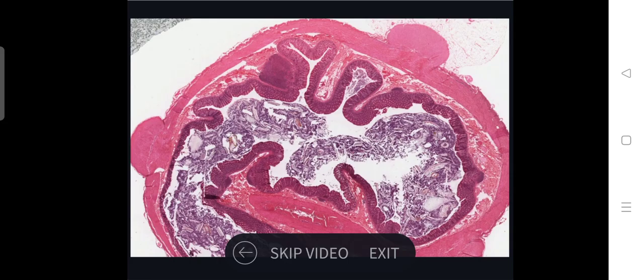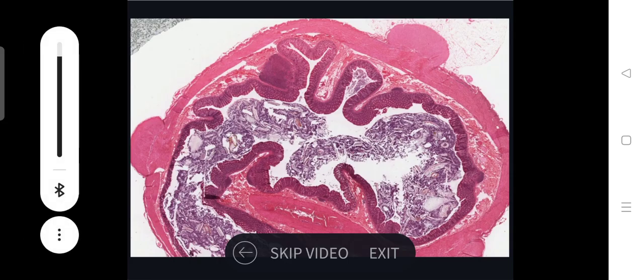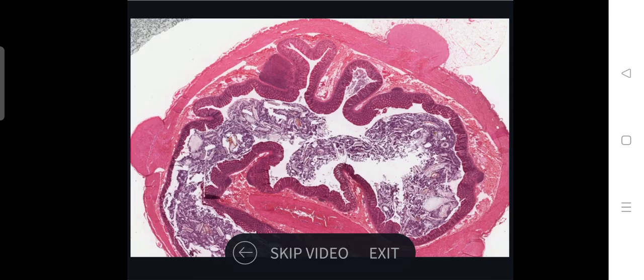The large intestine, or the colon, conforms to the essential features of the gastrointestinal tract. Here's the lumen. So we've got the mucosa, including the muscularis mucosa, the submucosa, muscularis externa, and then the serosa. A principal specialisation of the colon relates to its external longitudinal smooth muscle layer.